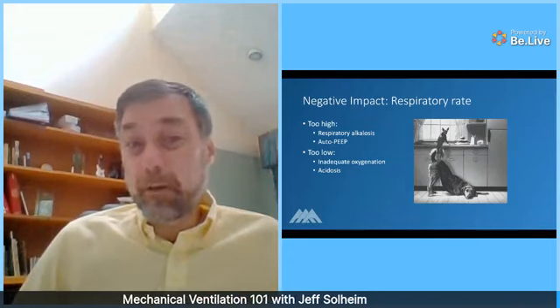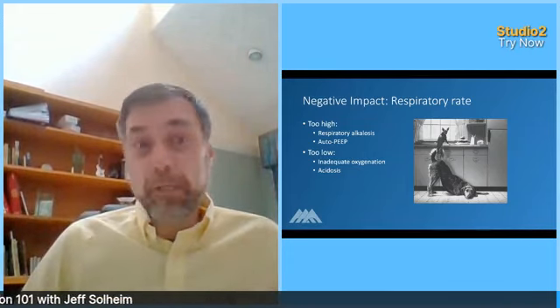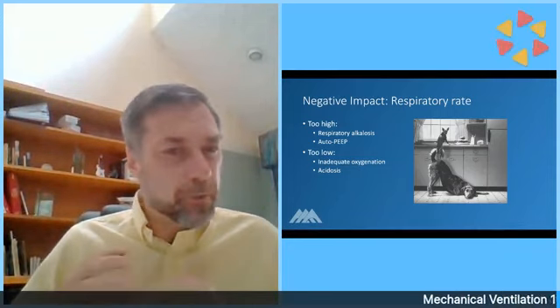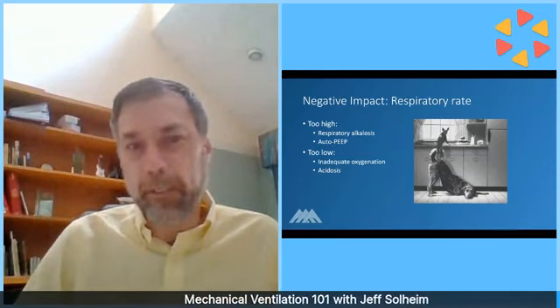Now, sometimes, like when I'm flying with a patient, I'm one-on-one with my patient. I'll use higher respiratory rates than 20, but that's because I'm sitting at the bedside and I can carefully monitor the pressures on the ventilator. I can watch to make sure the patient's fully exhaling.